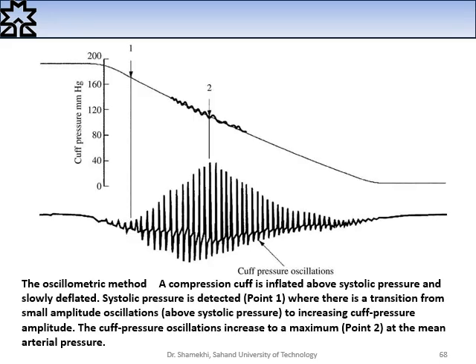In this figure, the procedure of oscillometric pressure measuring has been shown. As you can see, a compression cuff is inflated above the systolic pressure and slowly deflated.